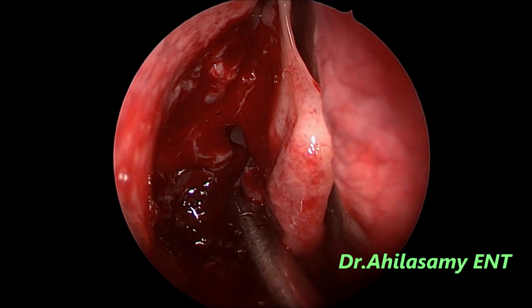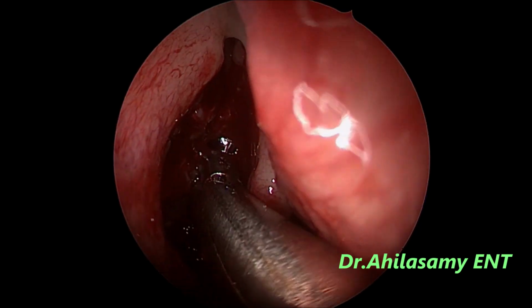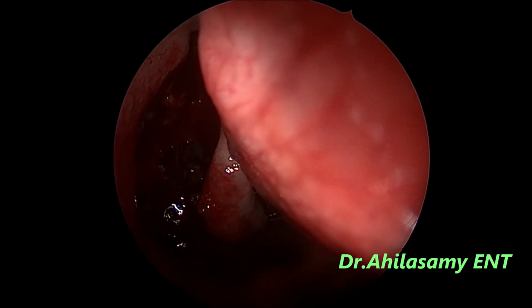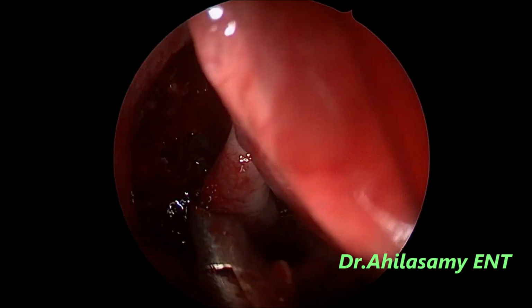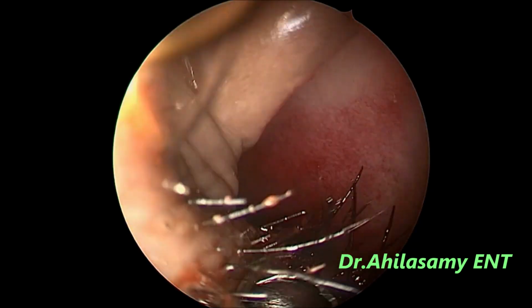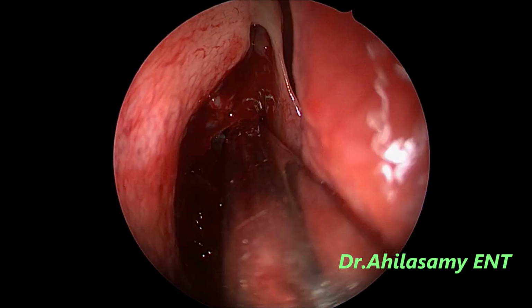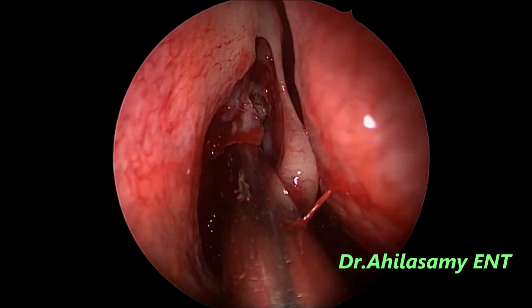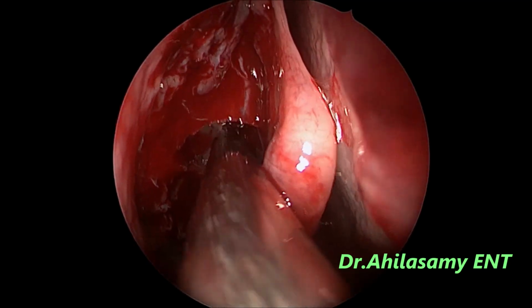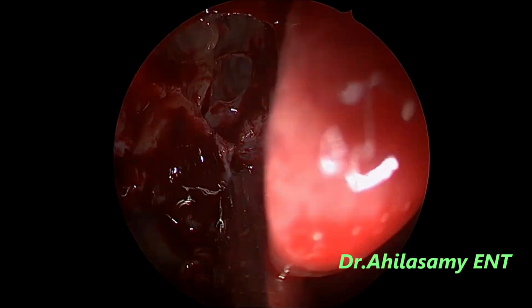Friends, dears, and everybody, please start learning to do under local anesthesia, and you can achieve a lot, and the patients will all be very happy. We do all these cases as day care procedures. Previous night I admit, the next day morning I operate, and same day evening I discharge. We never pack any of these cases, and no packs, no painful pack removal, etc.